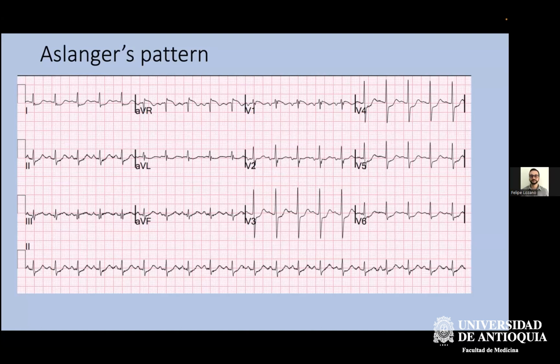Yeah, sure. I think that we have a group very interested in this type of artificial intelligence, so it will be a good opportunity for them and for us to implement this type of technology in our practice. There is another question, Dr. Smith, because as we saw, maybe the guidelines don't recognize today these subtle findings in the ECG. Do you think that with this evidence, the next guidelines for acute coronary syndrome, this diagnostic recommendation will change?